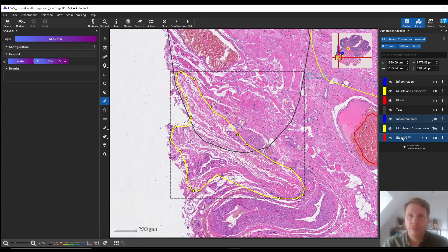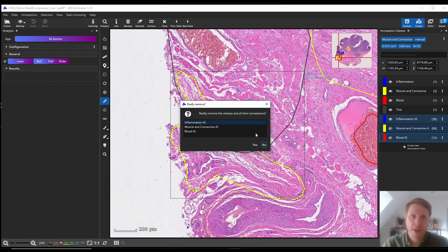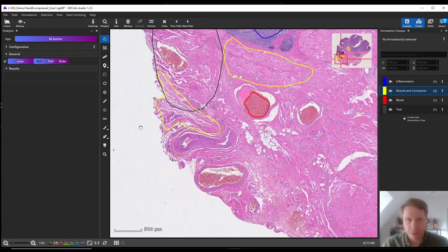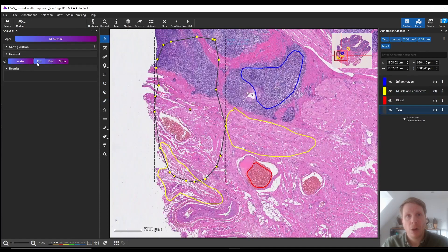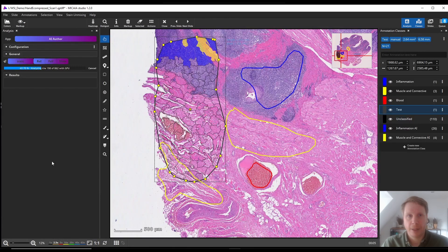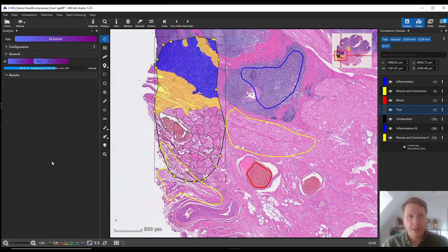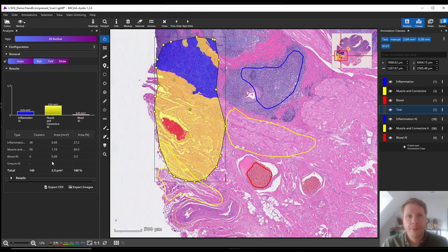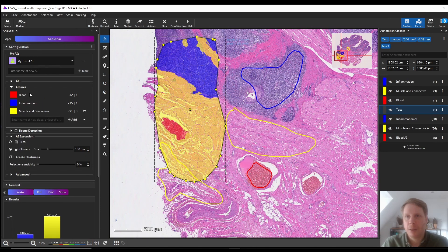We also had not included this particular phenotype of the class in our initial training annotation, so the AI couldn't know that it should have assigned it into the muscle and connective class. That's why we added a new training annotation, telling the AI that this is also how our yellow class can look like, and now we repeat the test analysis and this time it looks much better.